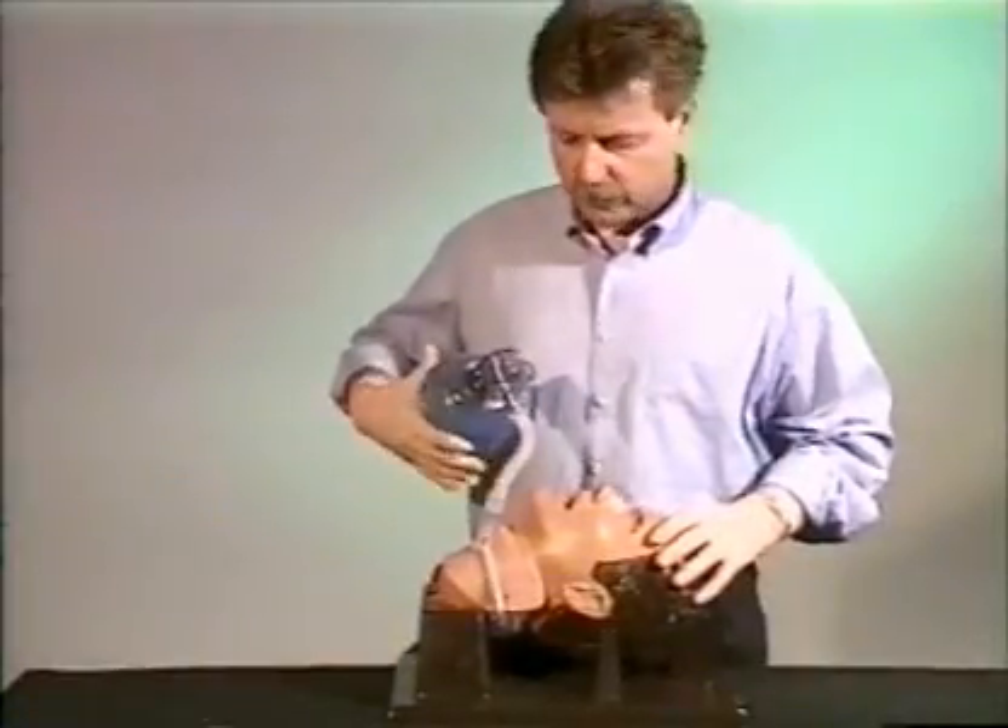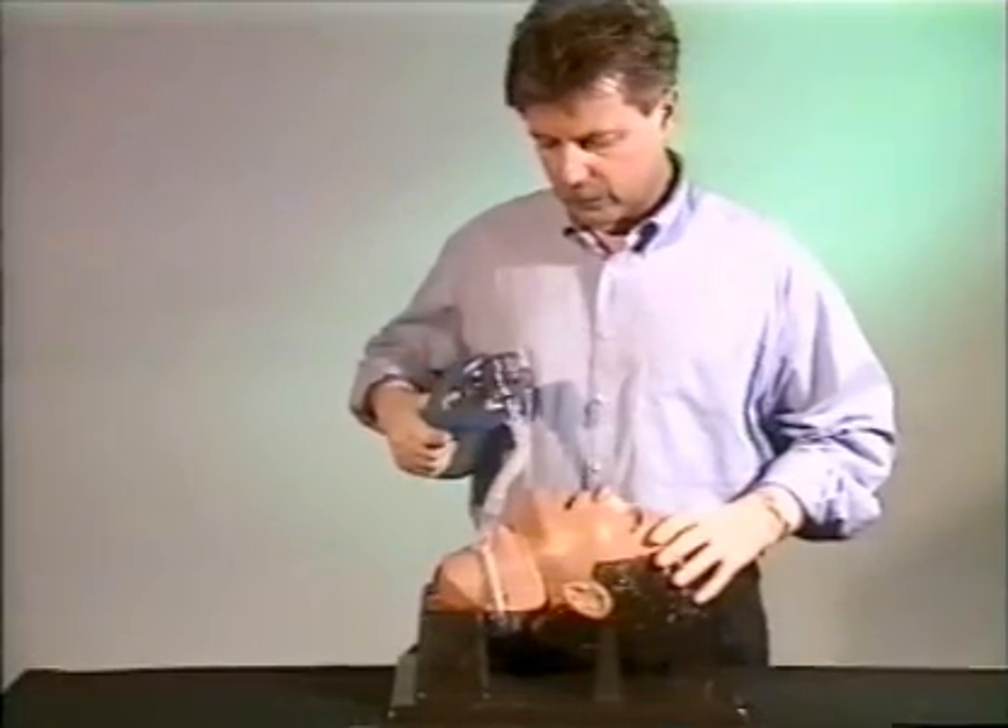Finally, ventilation is checked by auscultating both lungs. The patient is now ready for further medical care.